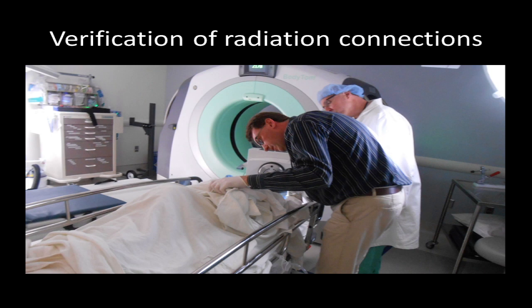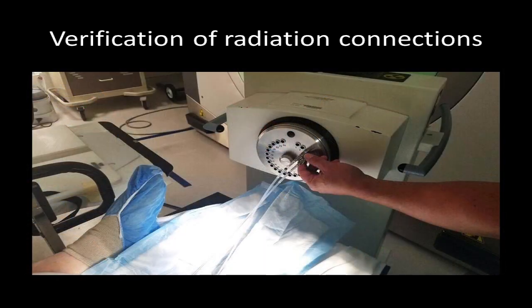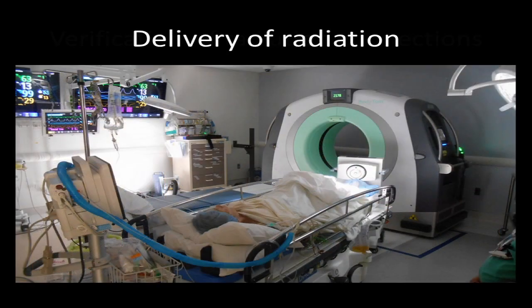There will be an initial test run that does not deliver any radiation, but confirms that all the connections are secure, and the treatment plan has been successfully loaded into the computer, and that the machine is successfully communicating for that treatment plan. Once we have confirmed that all components are working as expected, the real radiation treatment will begin and will be delivered as planned.